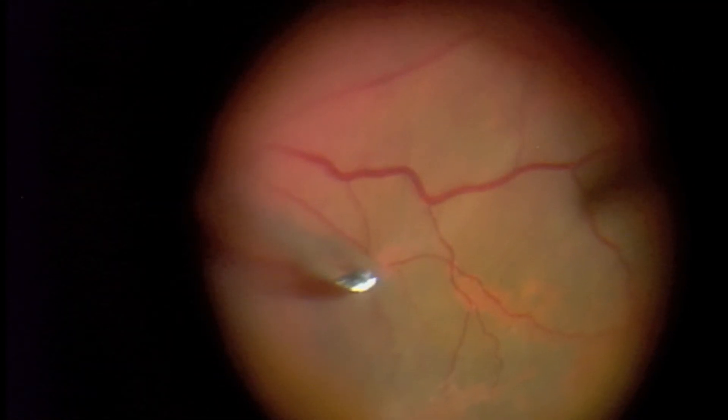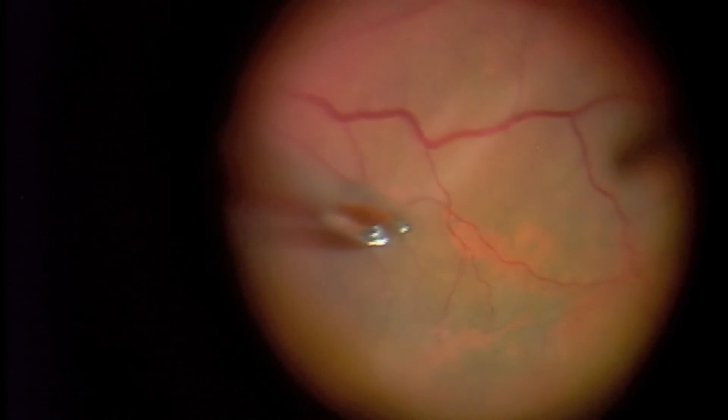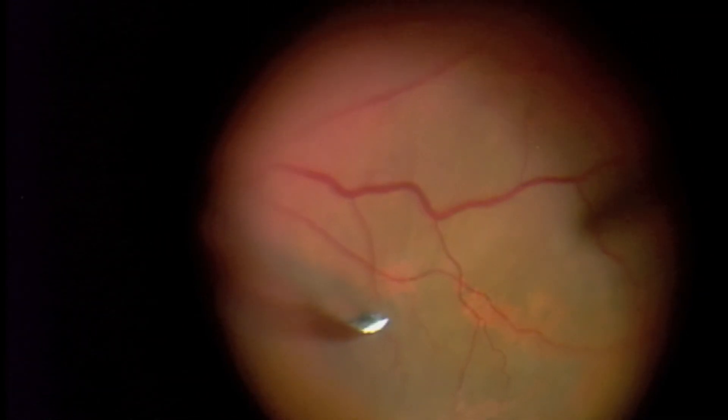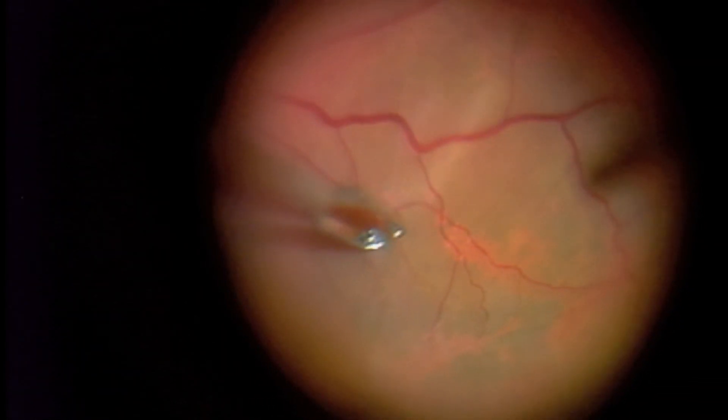So I'm starting to peel the membrane off to the side of the macula. And the membrane usually comes off in one or two sheets as it does here.